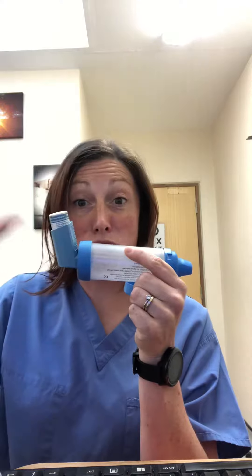You should then remove it and shake it and spray again for your second dose. I'm a bit lazy so I just shake it with it in and spray my second dose.